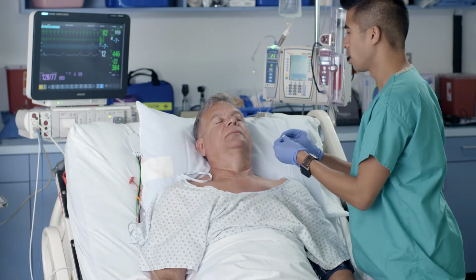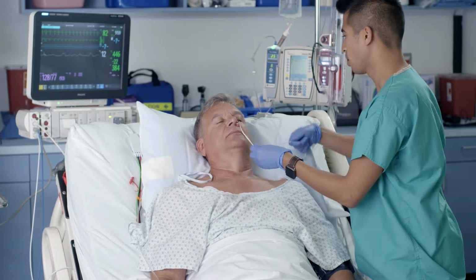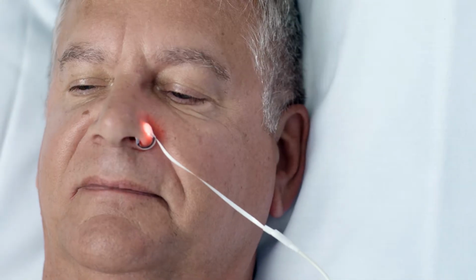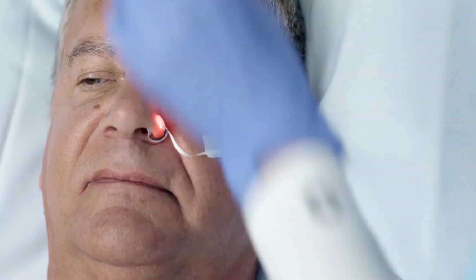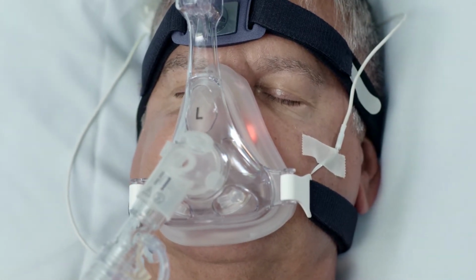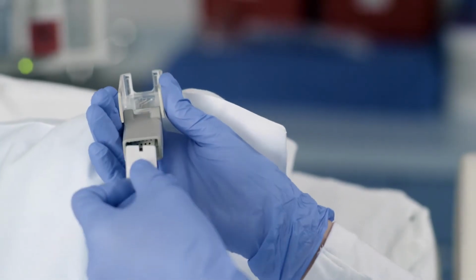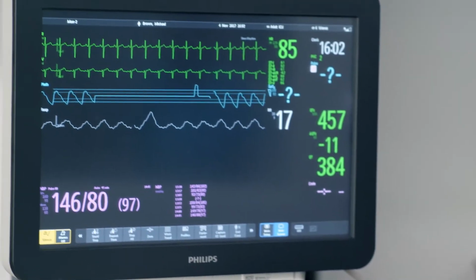To ensure patient comfort and mitigate motion artifacts, it is important to secure the sensor once applied. We recommend running the cable under and around the ear. Should the ear be unavailable, you can secure the sensor over the cheek using skin-safe tape. The goal is to make sure the cable does not hang freely from the nostril. If the sensor is being used under a mask, such as CPAP or bilevel NIV, make sure to allow slack in the flat cable under the mask so the sensor is not dislodged. Once connected, give the sensor a few seconds to communicate with your existing equipment and provide a strong signal.